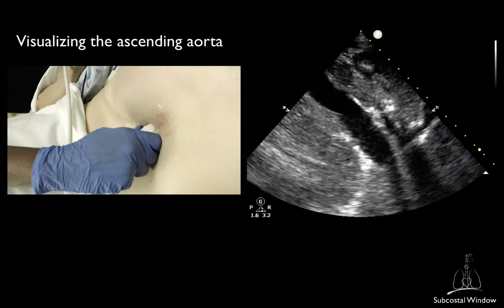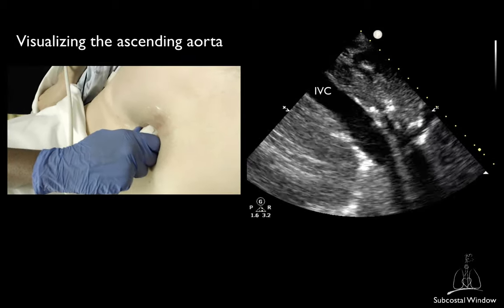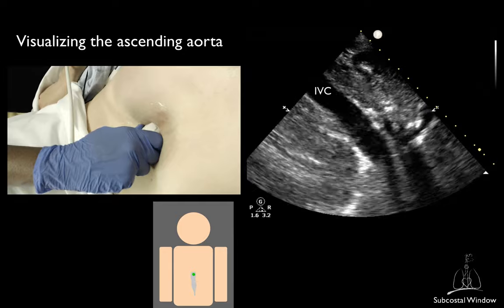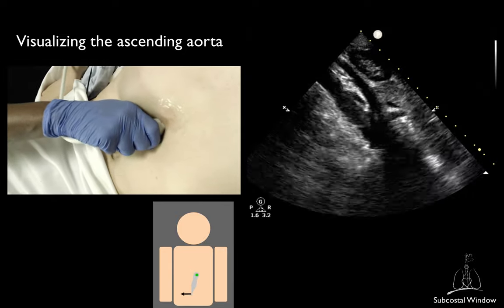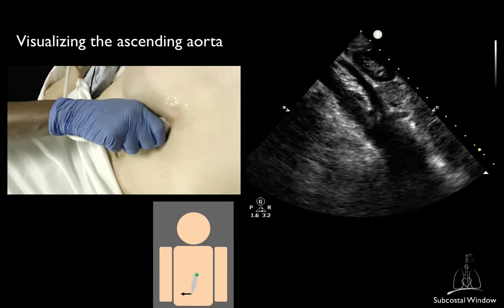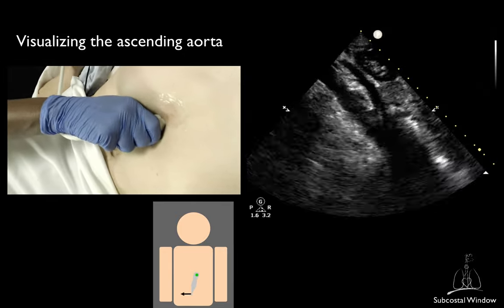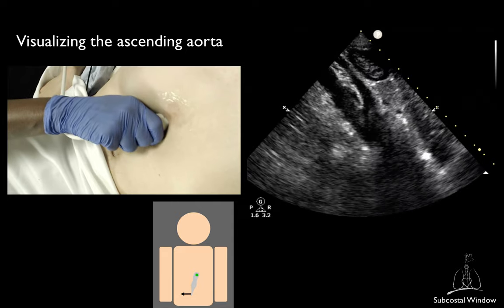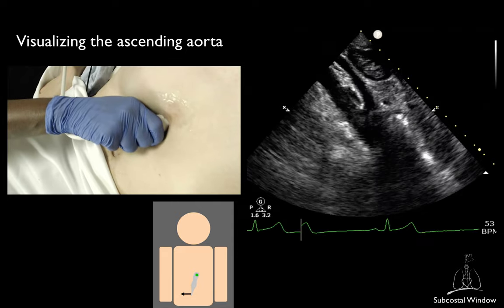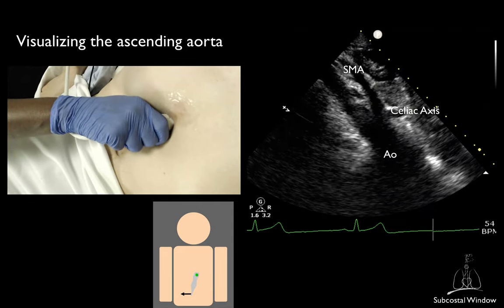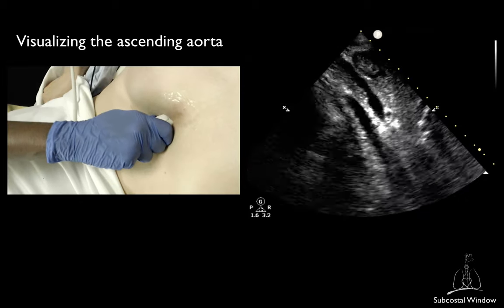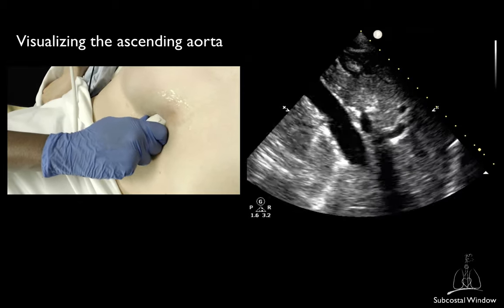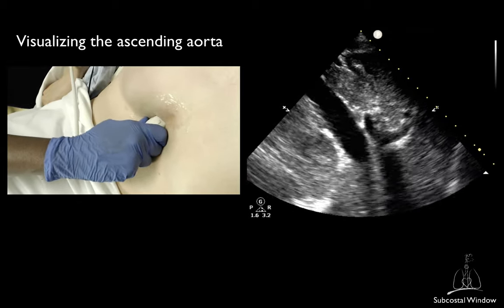To obtain the descending aorta view from the IVC view, just tilt the footprint towards the left of the patient, or slide slightly to the patient's left. You may have to adjust your rotation to open up the aorta.